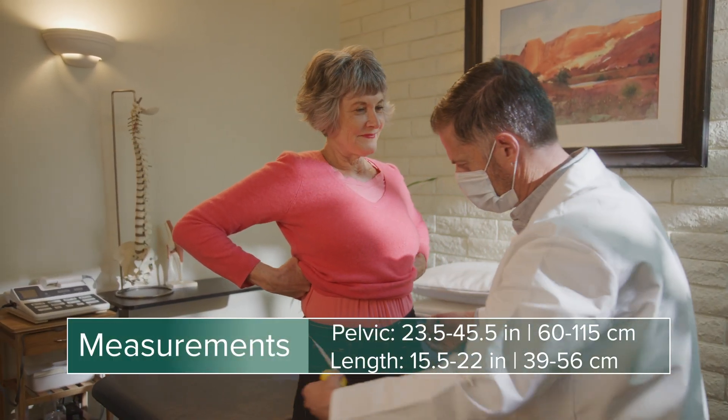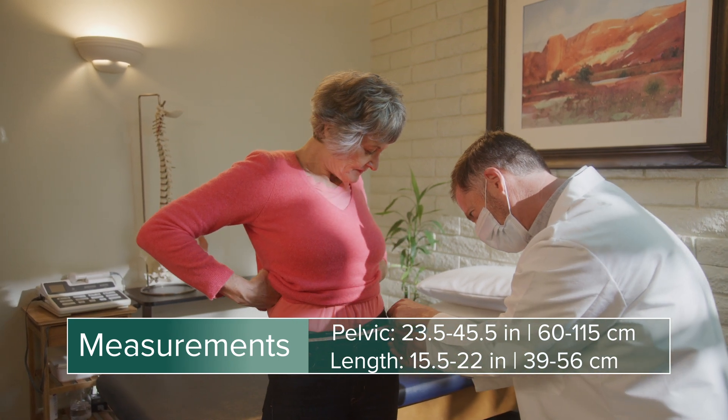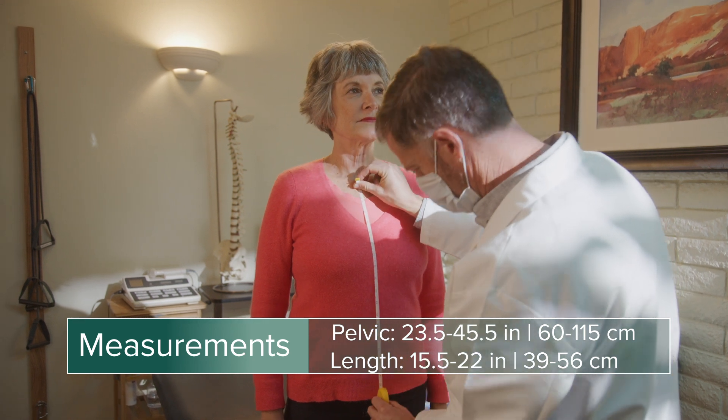Clinicians can size the brace by measuring the patient around the widest part of the pelvis. Measurements should also be taken from the pelvis to just below the sternal notch.